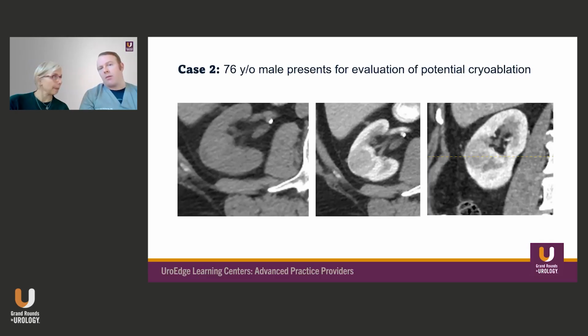So this is probably a larger T1A lesion. Okay. So just under 4 centimeters. Mm-hmm.